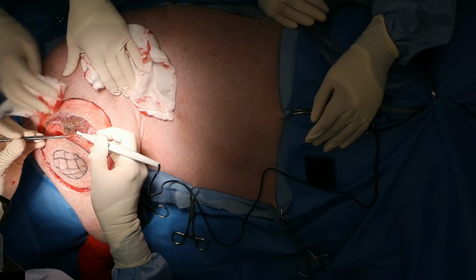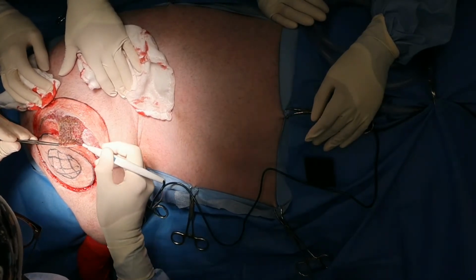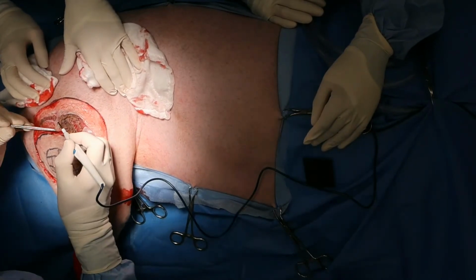The other thing we could have used here would have been laser, because you don't get the muscle fasciculations that you do with the cautery.